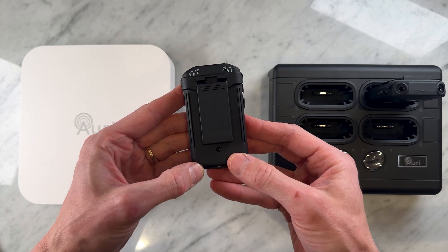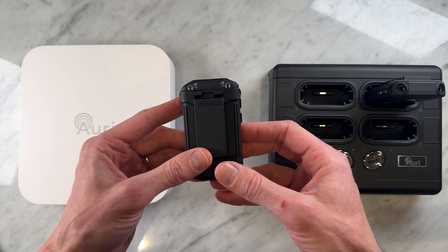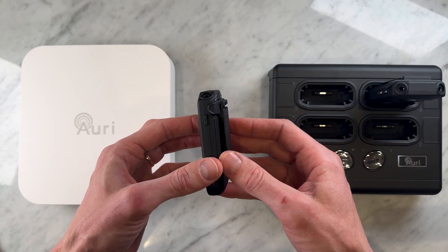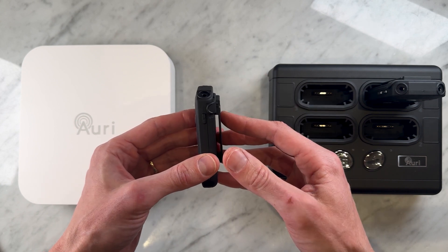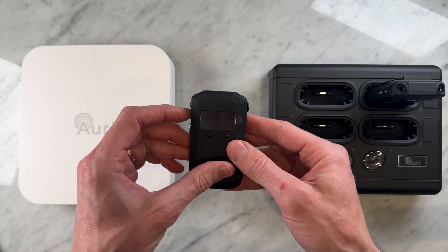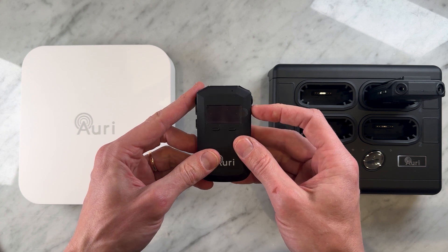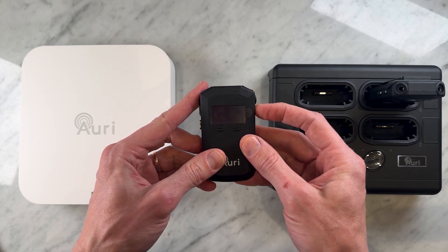From a practical standpoint, it features a rechargeable lithium polymer battery offering over 20 hours of continual use, with a full recharge taking just four hours. From a usability point of view, you can see the OLED display showing channel information, battery status, signal strength, and volume levels.